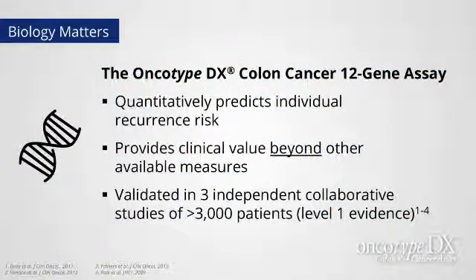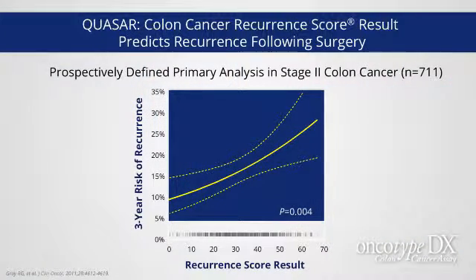Not necessarily a magical score that's predictive, above which you would treat and below which you wouldn't, but I think it's a very good guide as to which are going to be the more aggressive tumors, and much more accurate and reproducible than we can be with histopathologic features alone. So this is a gene expression test that can actually help quantitate the individual personalized risk of recurrence. That's correct.